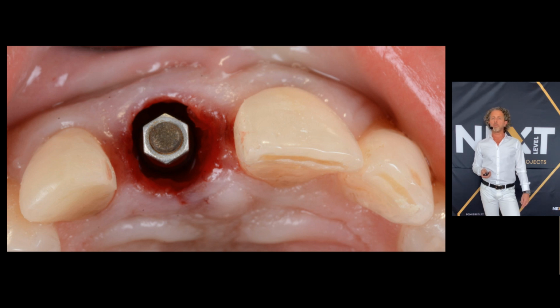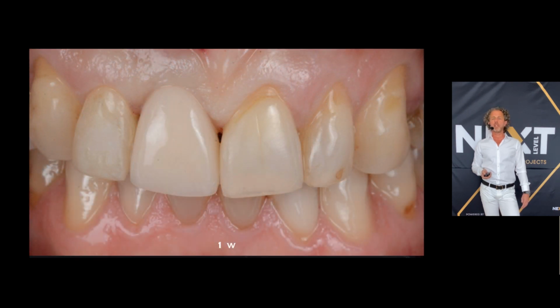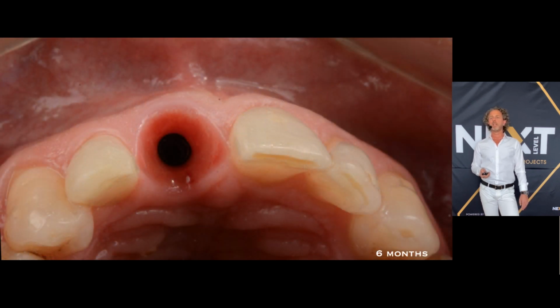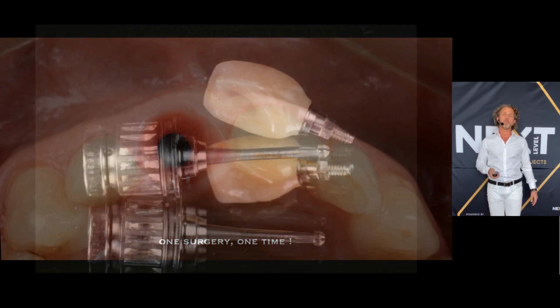I always measure the ISQ of the newly placed implant, and this is how we ended up. And this is just 1 week of healing. No incision, no swelling, no bleeding. Very nice. Look at how the temporary shaped the soft tissue around my implant. This is the 6 months follow-up. Exactly identical tissue profile. So it's the concept of 1 surgery at 1 time.